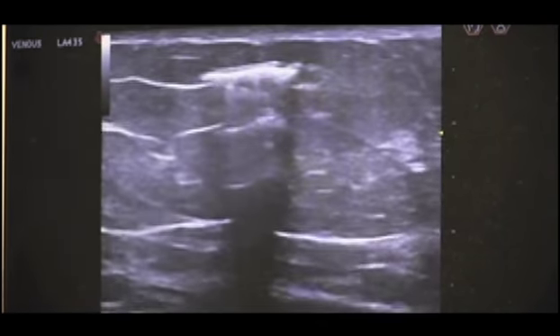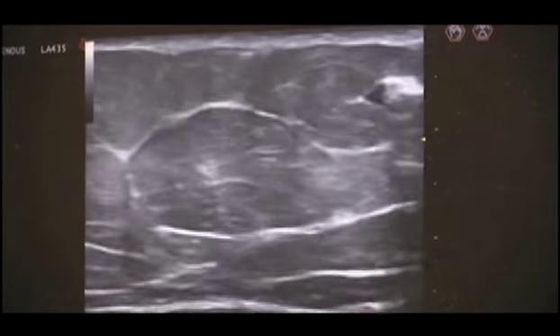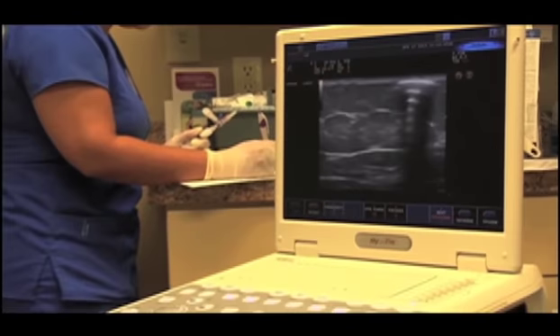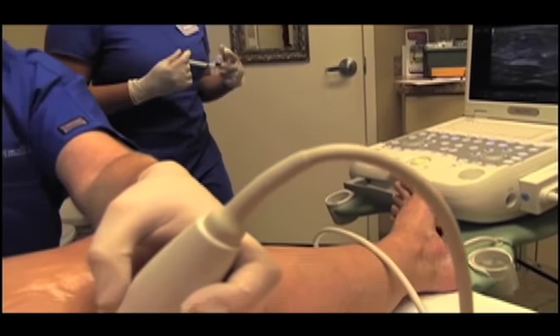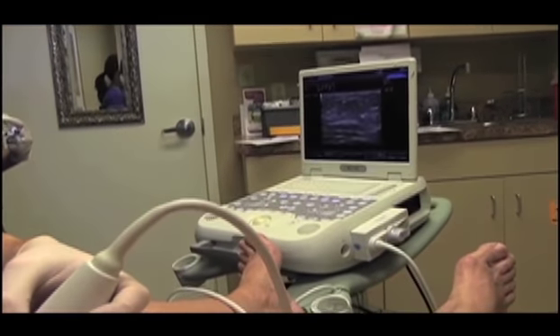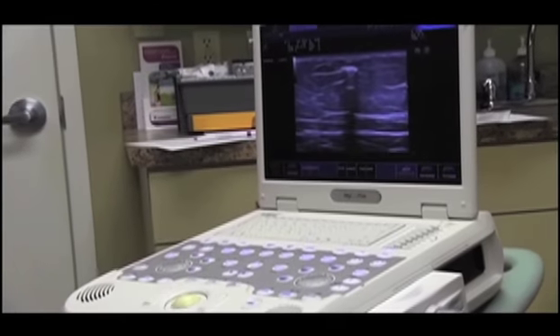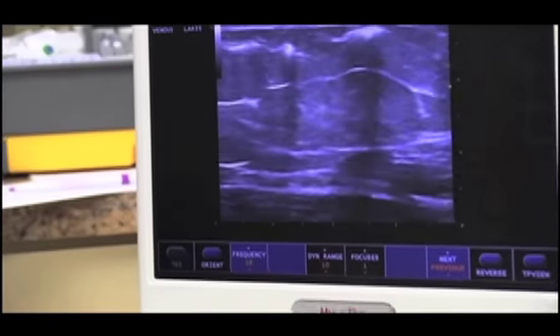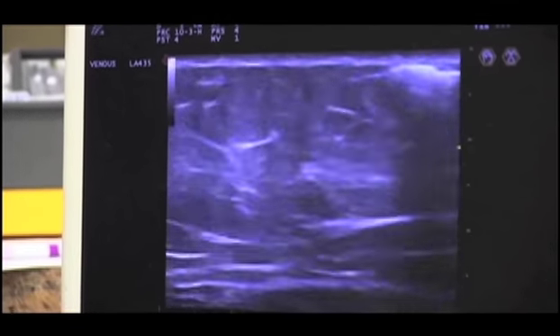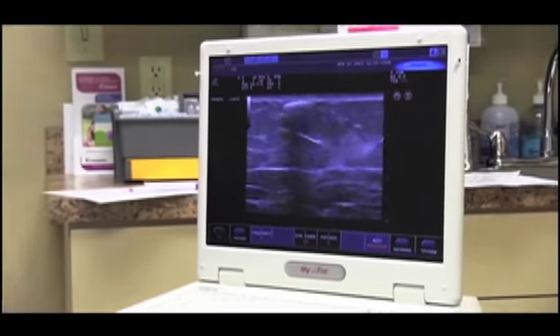Previously you saw that vein doing winky winky when I compressed it, but now it's totally gone into spasm — literally disappeared. The only thing left is that little snow in the vein. Now I'm going to take the ultrasound probe and push that foam carefully into these branches. It only goes a certain distance. Here's an open vein — that's what the vein above looked like before foam. It was a big floppy baggy vein, but now it's collapsed and disappeared.